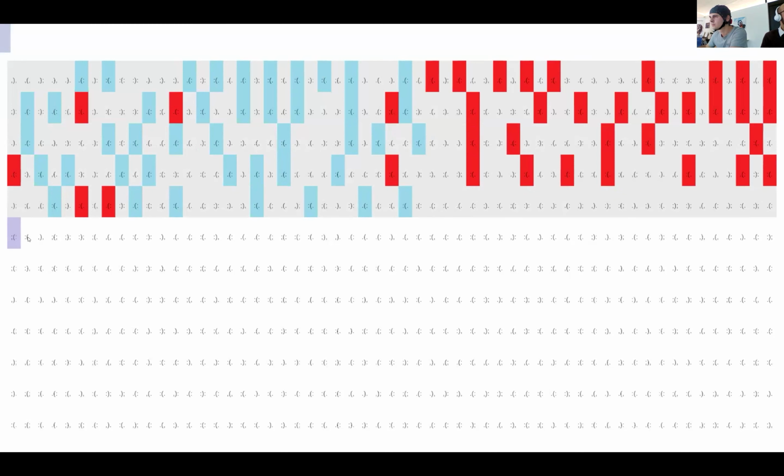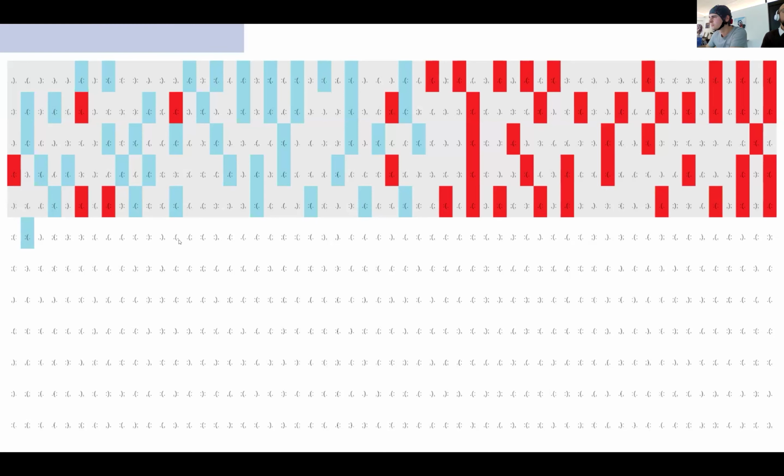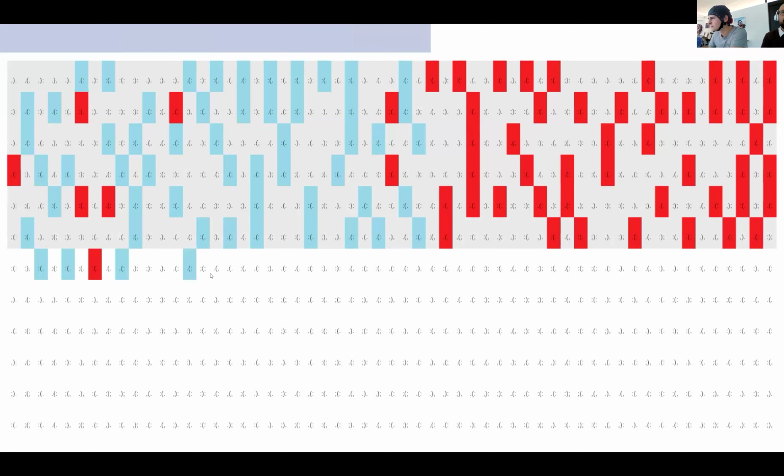For the classifier, we are separating the users on purpose, because when we are doing a median, we can actually have a higher accuracy rate. If a user is, for example, being pretty bad and not able to concentrate, then this will not highly affect the results of all the other subjects, which is what we actually want.